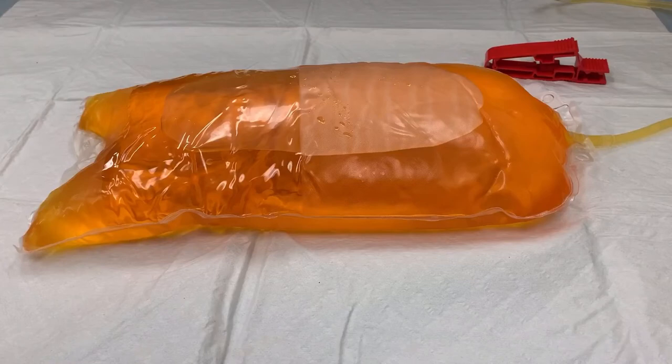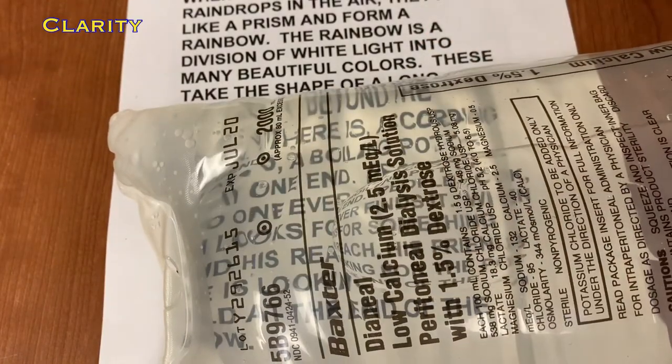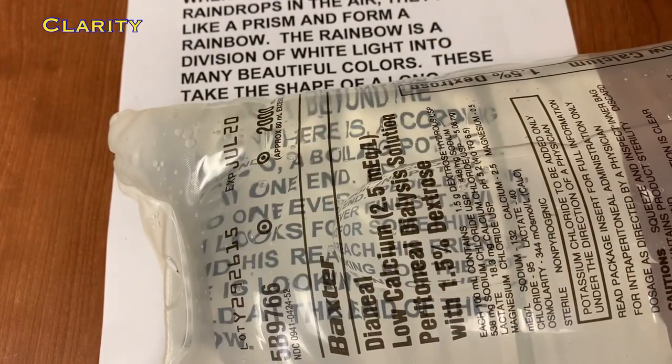We next need to assess our drainage fluid. We'll begin by looking at clarity. To do this, we'll use the same method we used when we were assessing the dialysate bag. Take your fluid and place it over any paper that has writing on it. If you can read the writing through the fluid, this is clear. If you can't, it's cloudy.